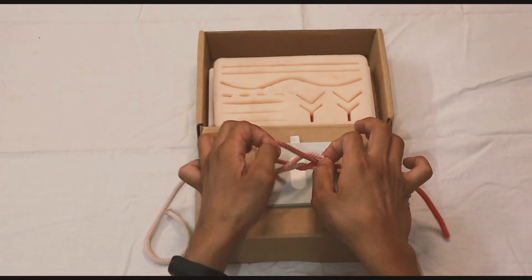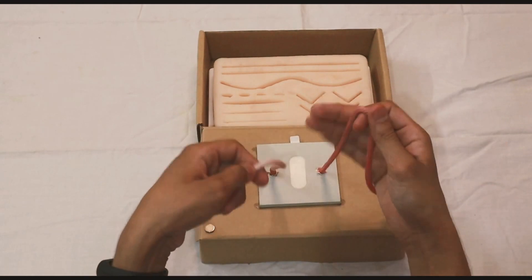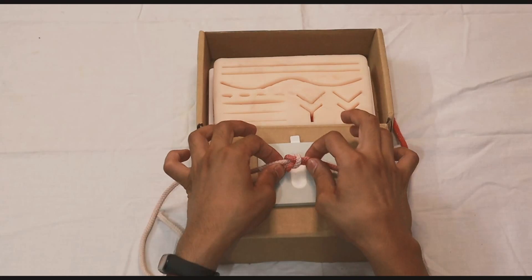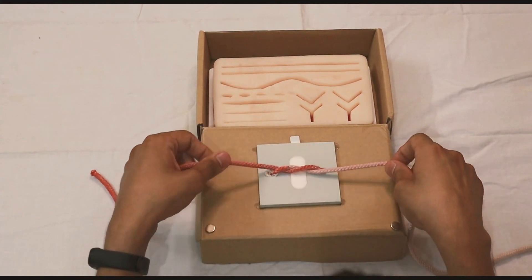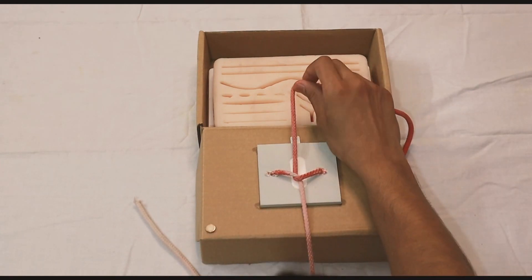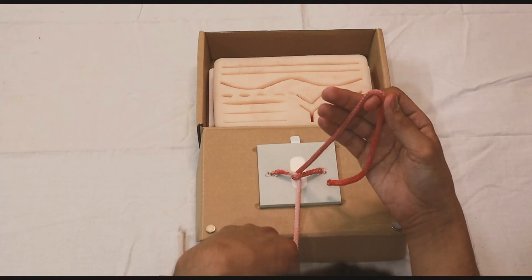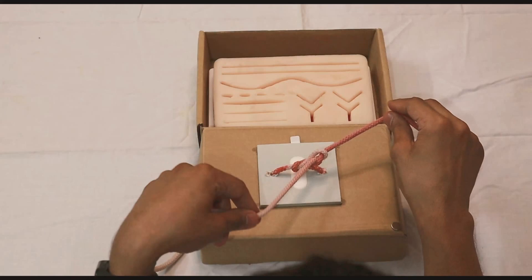Practice it and you will learn it shortly. For the granny's knot, the first throw is the same as the reef knot. But for the second throw, instead of switching method, you use the same index finger method again. This makes the granny's knot. This is how our granny's knot looks like.